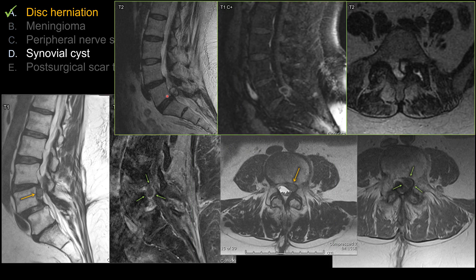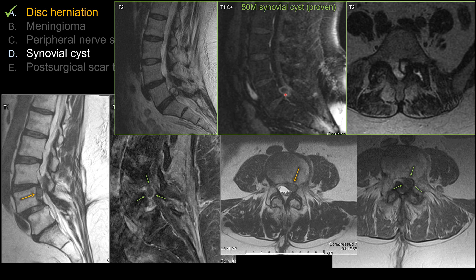Choice D is synovial cyst. This is an example of a biopsy-proven synovial cyst. At first glance on the sagittal view, it could look very much like a disc herniation or disc extrusion. But remember, a synovial cyst is a cyst, so centrally it should be bright on T2, whereas disc tends not to be bright. However, a heavily calcified synovial cyst can be dark on T2. The enhancement pattern — peripheral only, not central unless infected — doesn't always help. The key feature is its relationship to the adjacent severely degenerated facet joint and facet effusion, which is continuous with the synovial cyst. This can cause mass effect and nerve root compression, requiring surgical excision and pathologic confirmation.